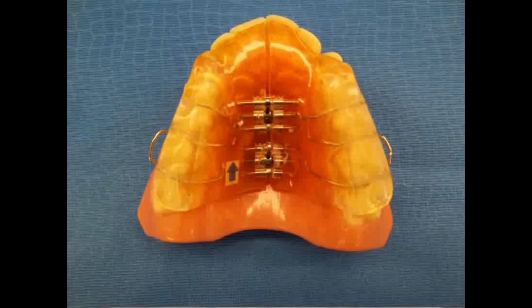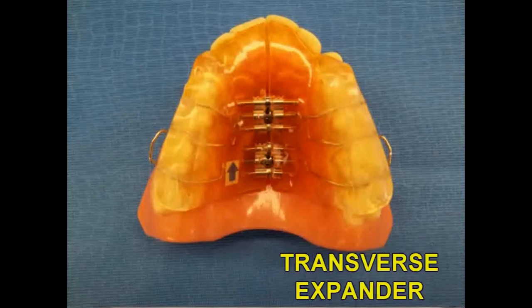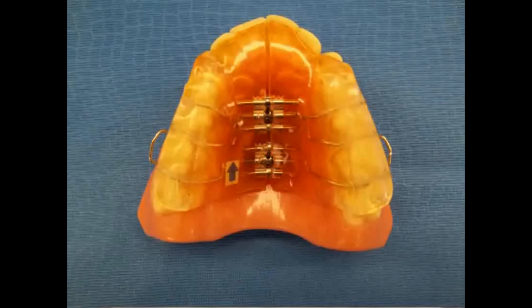For older patients, the transverse expander can provide better arch development and reduce the possibility of tipping the teeth instead of developing the entire arch. The older the patient, the longer you'll need to retain the expansion to prevent relapse. Anytime you have a posterior crossbite, this appliance can be very helpful to expand the arch to jump the crossbite.